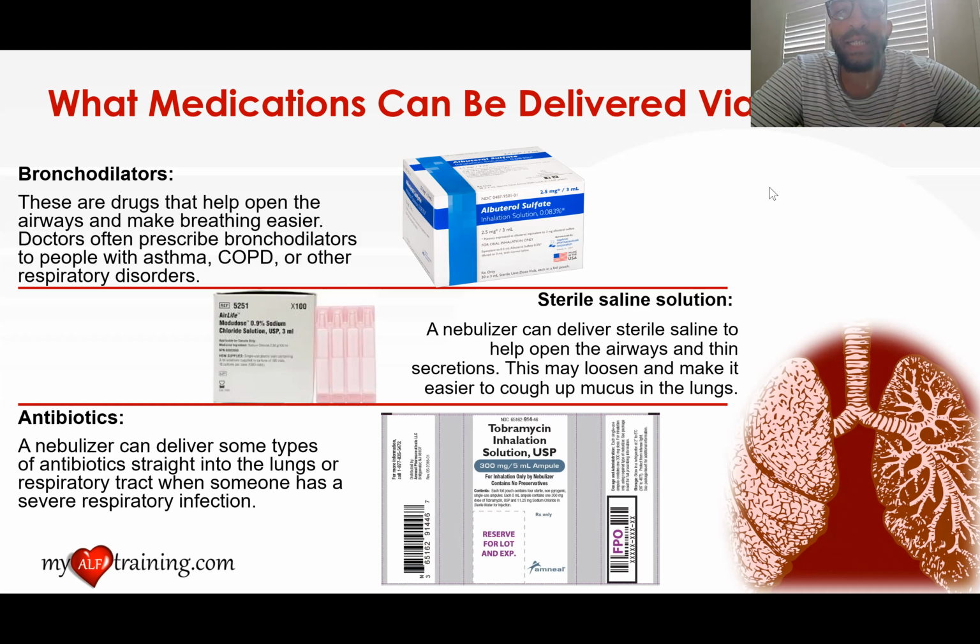It doesn't exactly help the patient breathe easier. It doesn't exactly help to loosen or extract any mucus from the patient, but it does help to kill bacteria that has somehow gotten inside the lungs and is causing the patient this infection inside their lungs, and it's going directly into the lungs. So it's very effective.